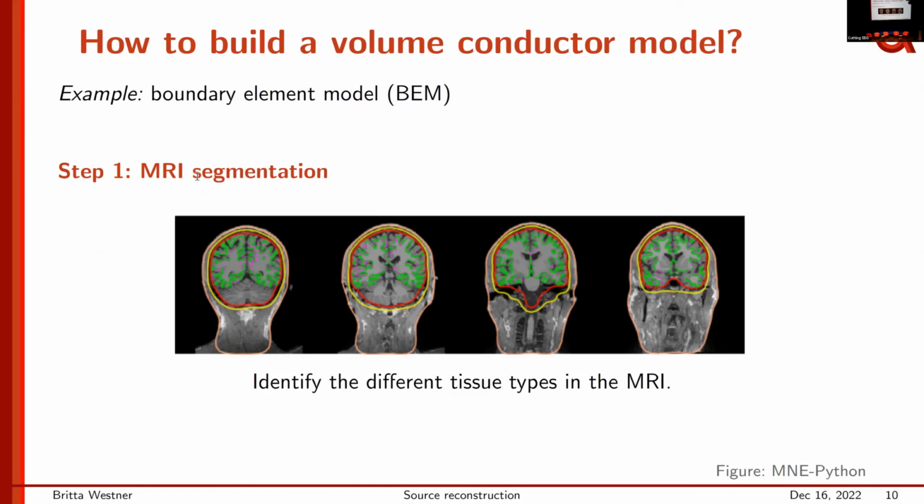So you don't know if it exists already, like somebody that already recorded EEG, this MRI, and this source? I mean, there are many papers that do simulations and also real data that assess how good things are in general. But for your own data, to get this goodness of fit measure, no. I don't want it for my data, I want, generally, something available to know if it is doable to check. For that, papers exist, especially also for EEG, that model how big the impact is of different head models, etc.